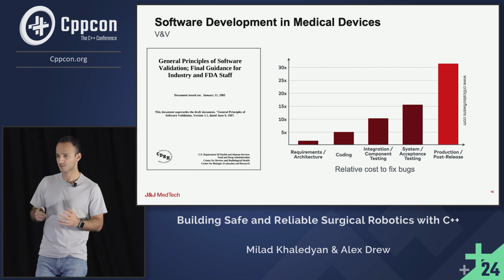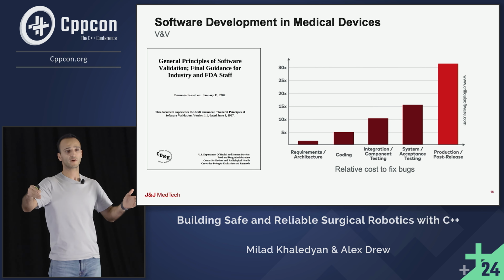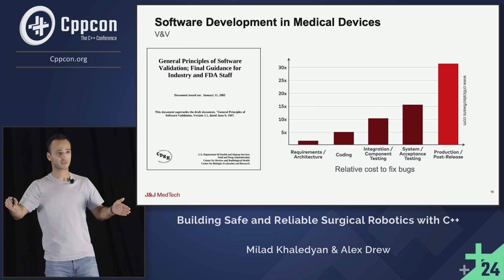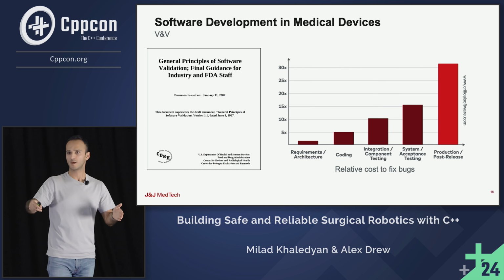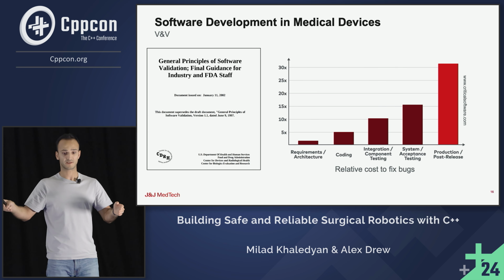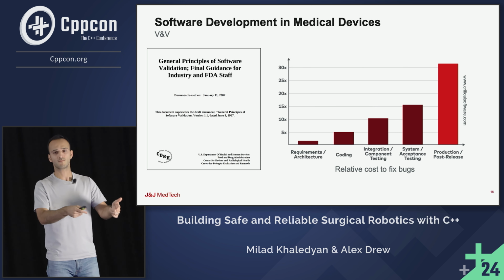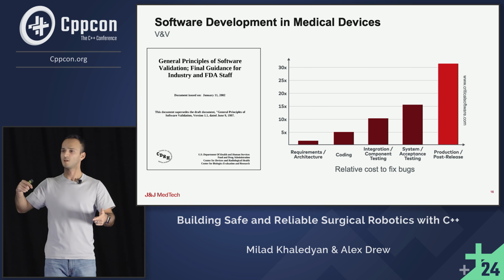Another important document in medical devices is the principle of software validation and verification for medical devices. Here the emphasis is testing. We can do anything to prevent failures, but at the end of the day, some failure could happen, right? The problem is we have to fail safely, with a fail-safe design. So here, the idea is you have to have 100% coverage. That means if you add even one line of code, you have to cover it.